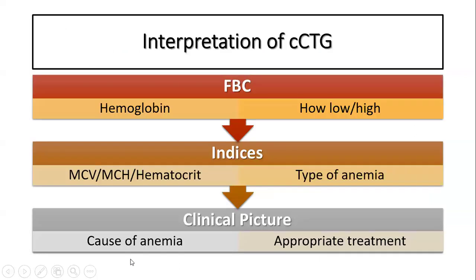So understanding what to do is like doing a full blood count. Generally, when you do a full blood count, you interpret and take your decision based on the clinical context in which it was done. Why did you do the full blood count? The index is not a full blood count. For instance, the patient came with an HB of 12, needed a cesarean section, and afterwards in recovery, you repeated the HB and it was 5, and the tummy was tense. Your treatment for that is to go back to theater, open the tummy up, stop the bleeding, and transfuse.